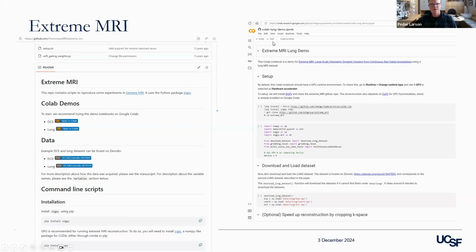And then the thing that Frank Ong, the student on this work, did was he used Google Colab, you see right up here, and created a sample way for somebody to use this. And I thought this was great, super low barrier to entry, right? You can launch Colab very, very quickly and have a nice starter set of code to go with it.